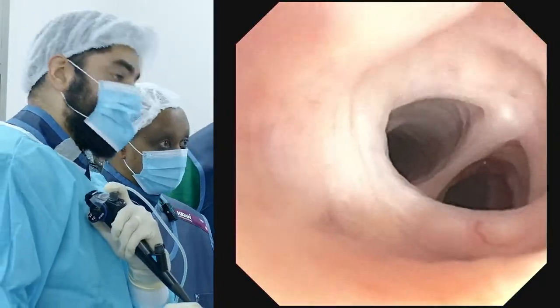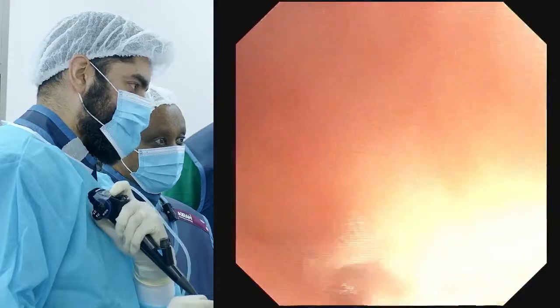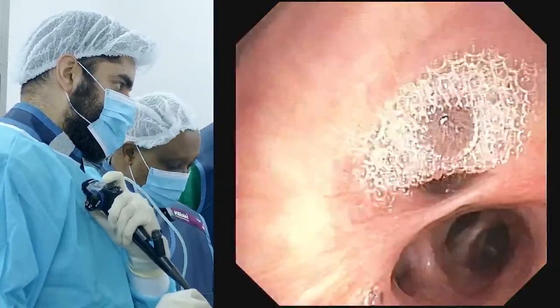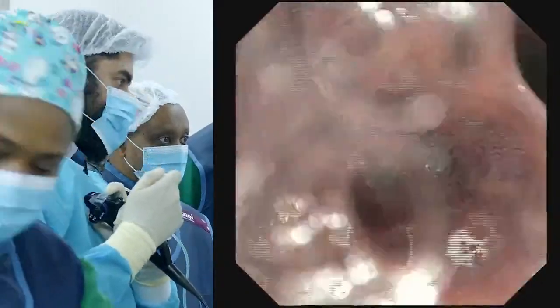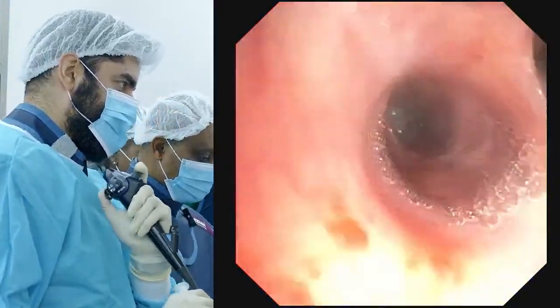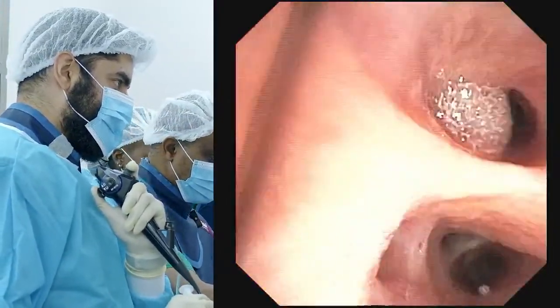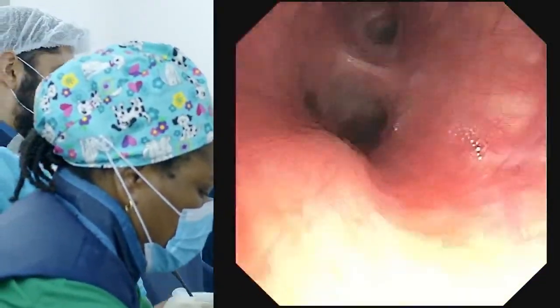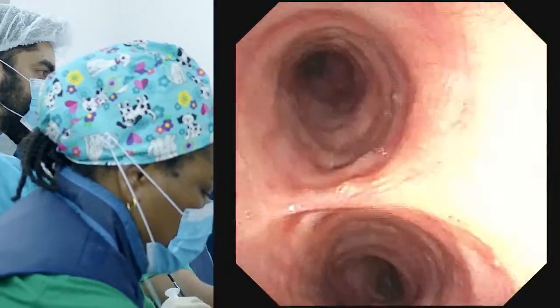The biopsy I'll do from the right side. The disease will be a little more dense there. And I'll put a little more saline on that side. You getting enough sample? Yeah, on this side you're good.